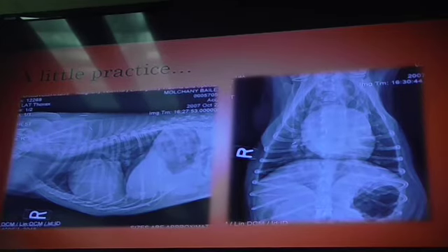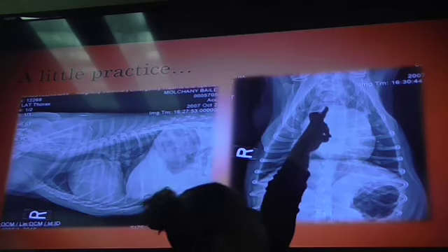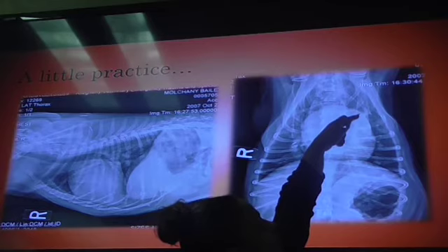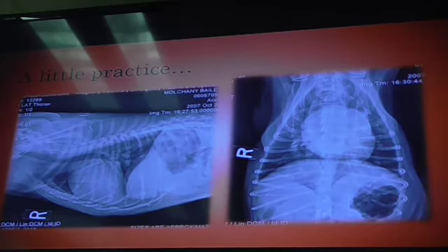I need to hear some enthusiasm, some interaction, because I'm not just sitting up here. I want to make sure you guys are solid before we start talking about the diseases. 2 to 3, 3 to 6. All right, so if we have 12 up here on midline, 1, 2. Y'all said 2 to what? 2 to 4. Some people say 2, some people say 3, I would say 2 to 3, 3 to 6. Somebody said 3 to 6. Somebody said 2 to 4. Why can't it be that side? You're throwing all of it, right? 1 to 6. Oh, okay, right.